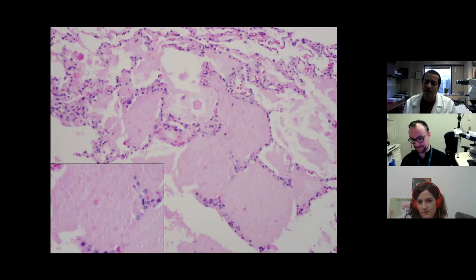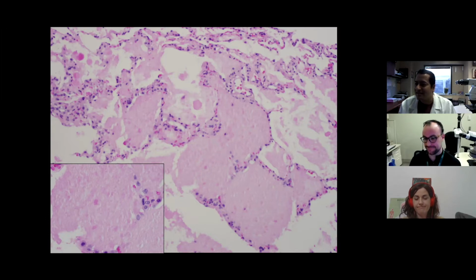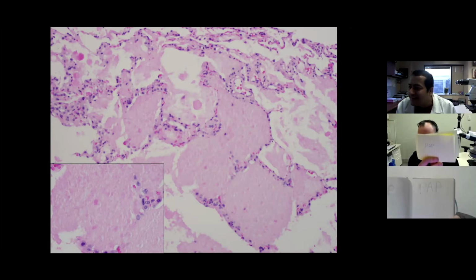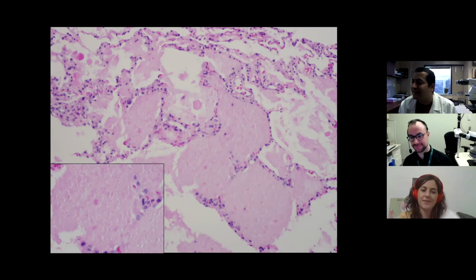This patient is a 45-year-old man, a smoker who was found to have bilateral abnormalities on the CT scan that the chest radiologist described as crazy paving. Diagnosis: pulmonary alveolar proteinosis. Congratulations on getting the pulmonary part right.